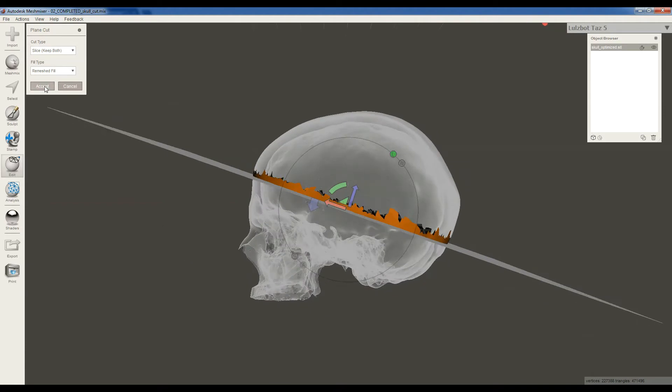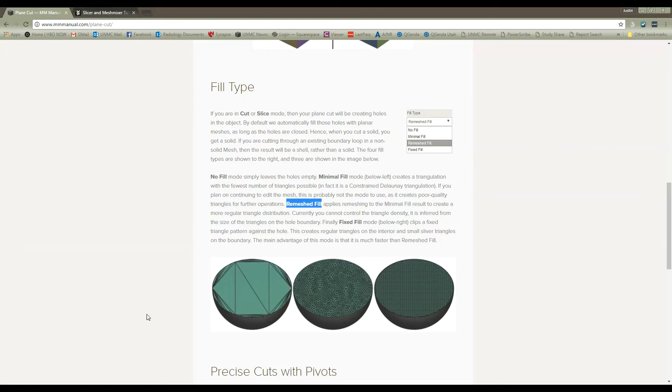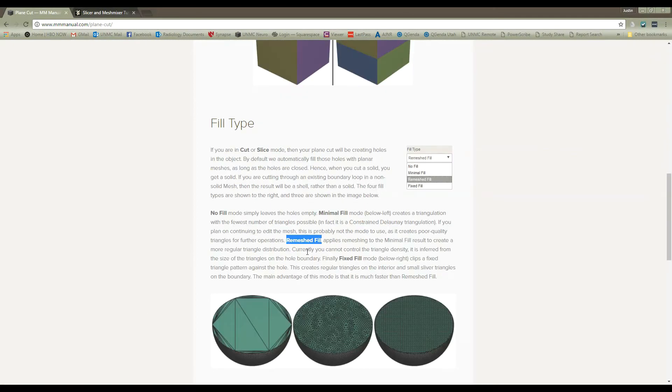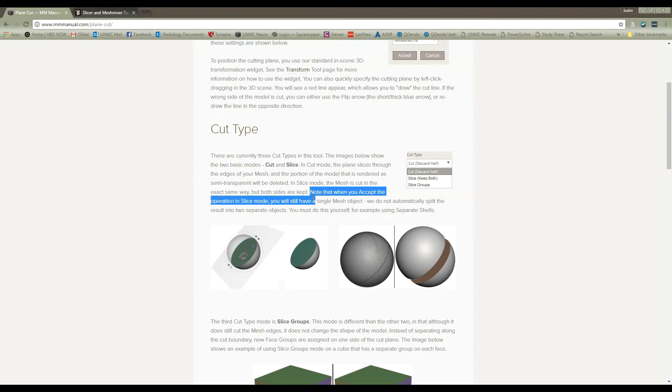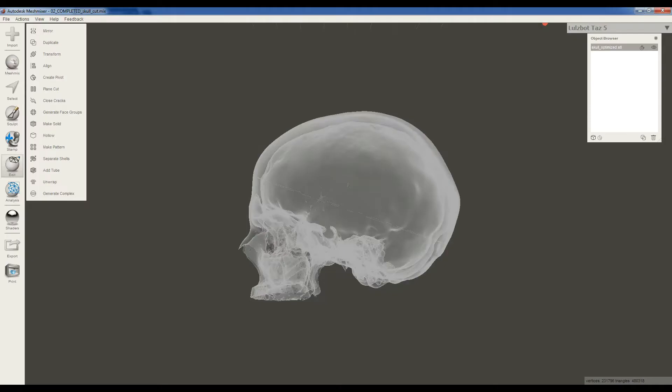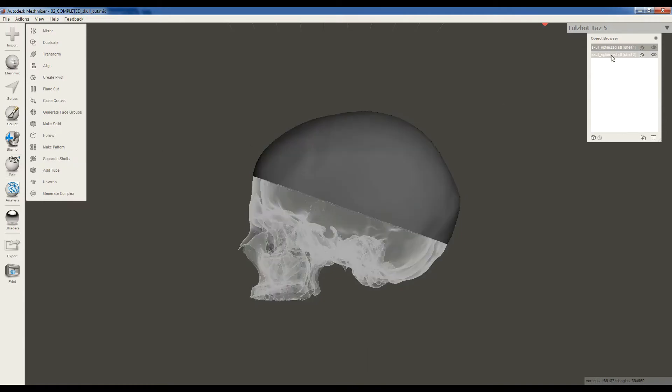And so we click Accept. Now if you're like me, you clicked Accept, you still see one object and you go, what happened? And this is a little bit counterintuitive, but they actually tell us in their tutorial, when you accept the operation in slice mode, you still have a single mesh object. We do not automatically split them. You must do this yourself, for example, using Separate Shells. So we need to do that also. So we go to Edit, Separate Shells, and there we go. Now we have two different models.